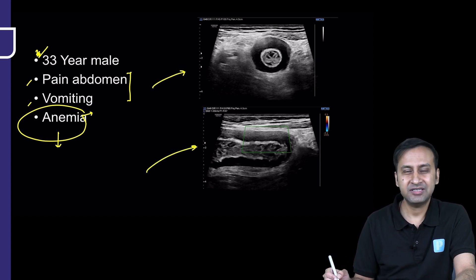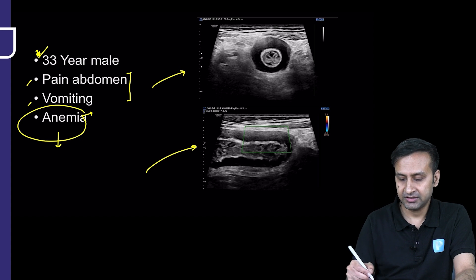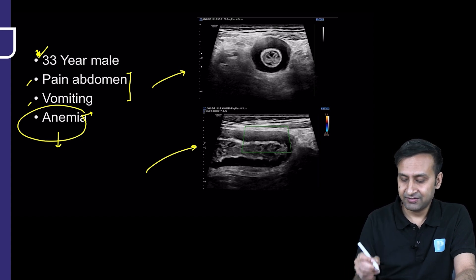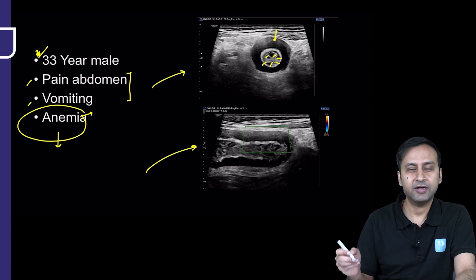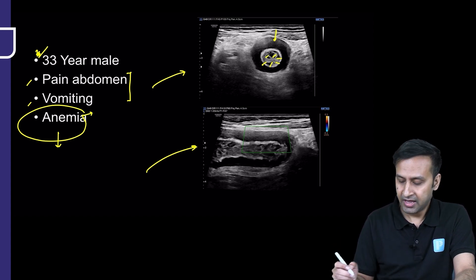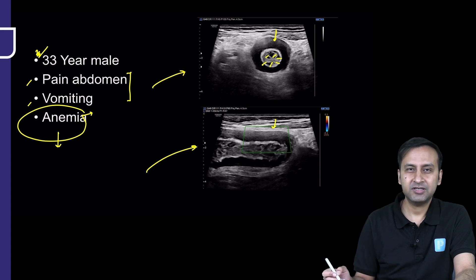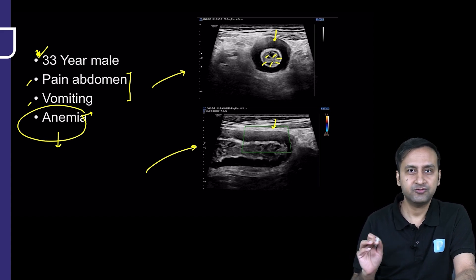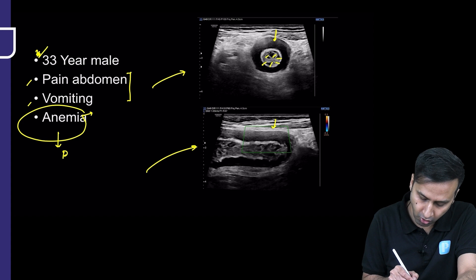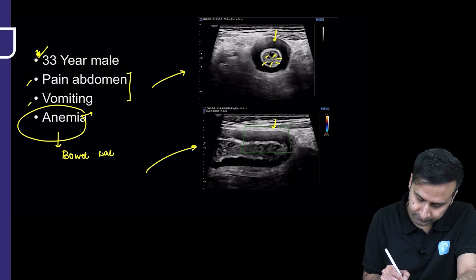On high-frequency ultrasound, there is classical bowel wall thickening — the bowel appears significantly thickened. To a great extent, the inner layer appears relatively spared, and predominantly it is the outer and middle layers that are thickened. On color Doppler, there is no significant vascularity in the bowel wall, but we are clearly dealing with abnormal bowel wall thickening.